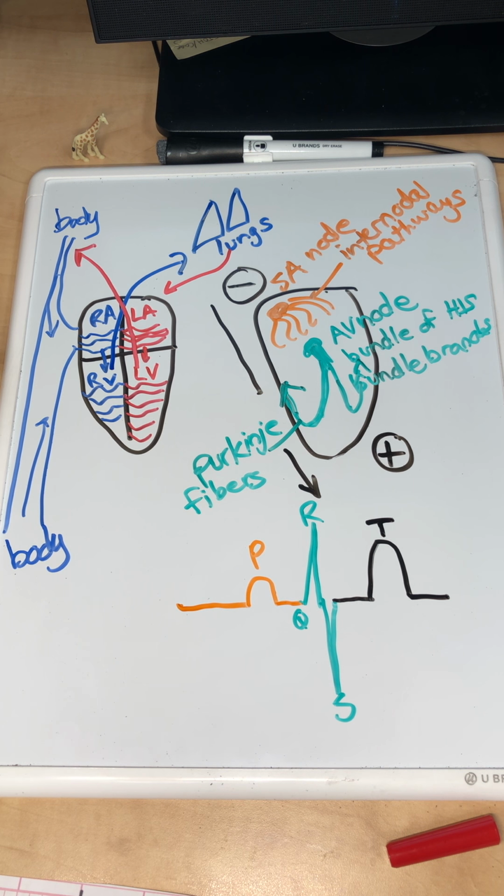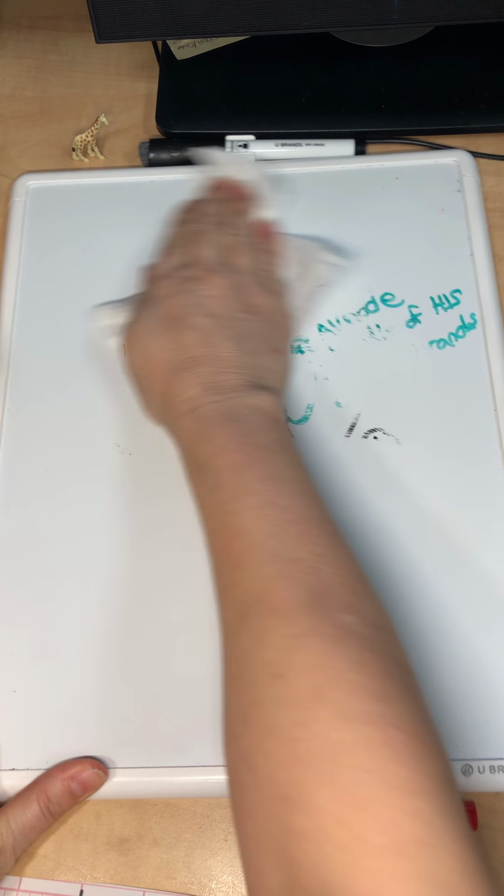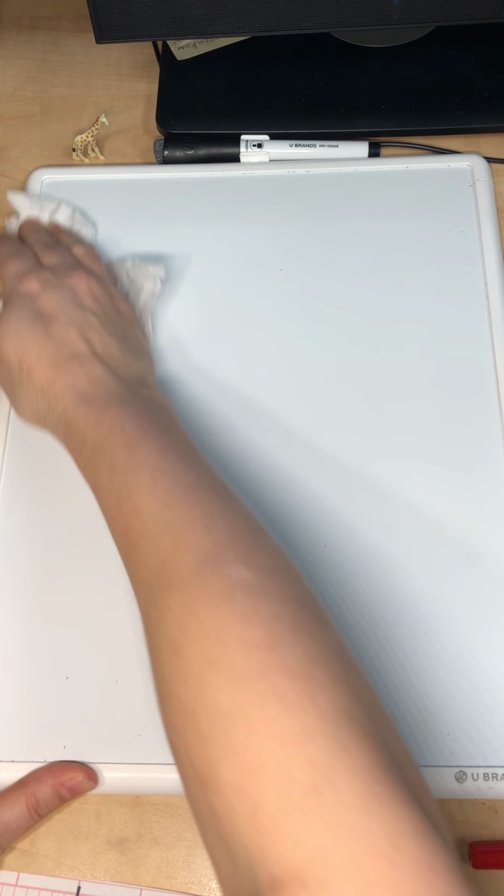So, with those fundamentals behind us, we can actually now talk about our basic rhythms, right? Our good rhythms. We want to know what the most basic, best rhythm is, and you probably remember this. You may know all of this already and don't feel you actually need a refresher, in which case, if you're interested in something more in depth, we have basic dysrhythmia classes, we have 12-lead EKG classes, so definitely look into those, but I'll continue on with just the basics.